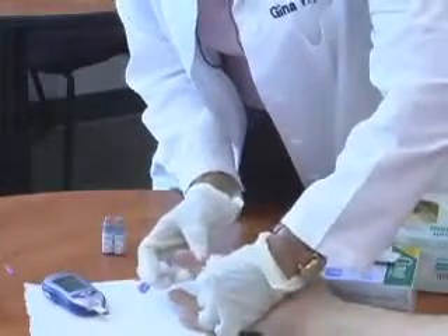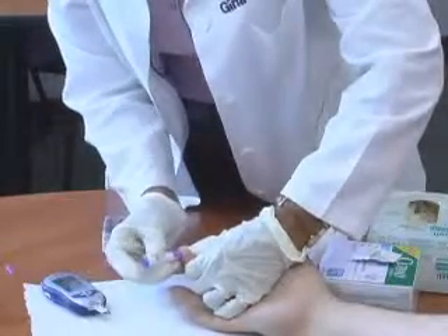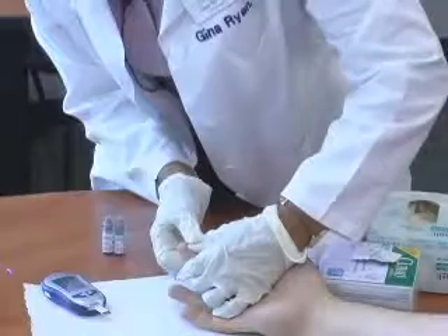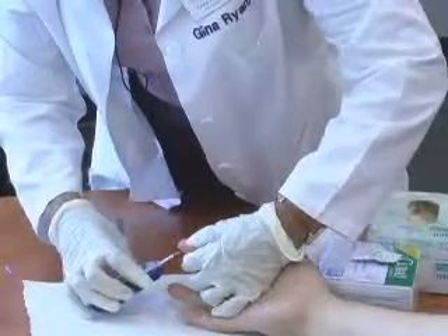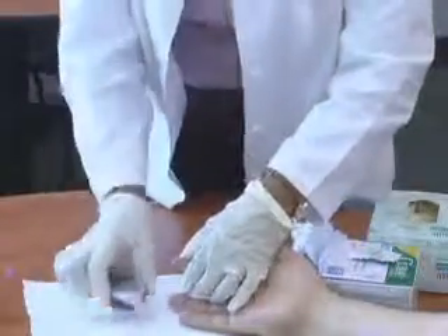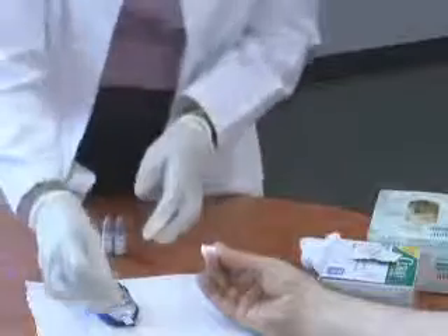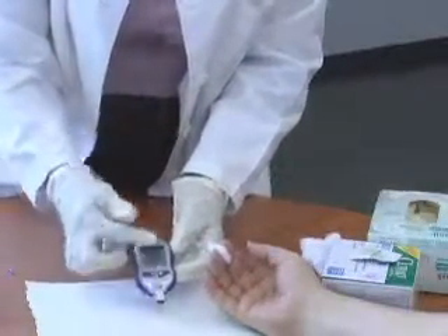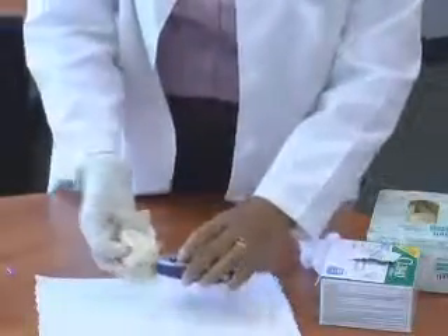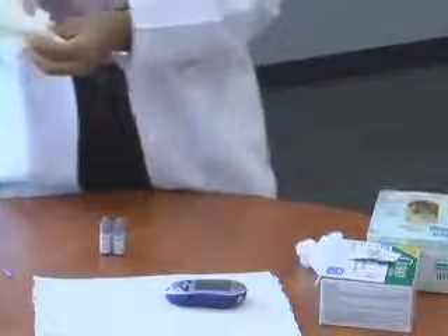I'll rub the finger from the bottom going to the tip — you can see it's getting pretty red. Press against the side, then press the lancet, and throw it directly into the sharps container. I see a lot of students who get a stick and then want to put the lancet device on the table — never put a used sharp anywhere other than in a sharps container. Pick the meter up, you can see there's a drop of blood. Take the tip of the strip and place it onto the drop of blood — it has a capillary action that sucks the blood right into the well. That well needs to be completely red. It takes very few seconds and he's got a reading of 95, which according to the American Diabetes Association is within normal.